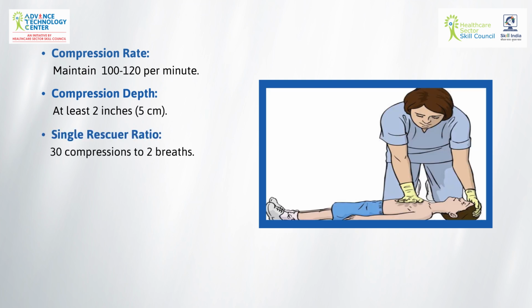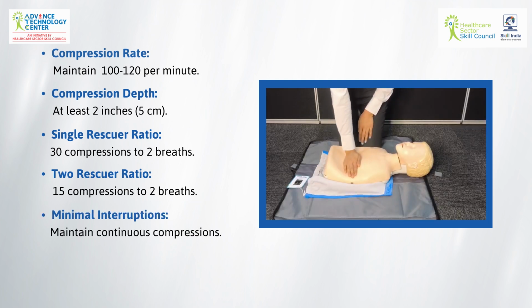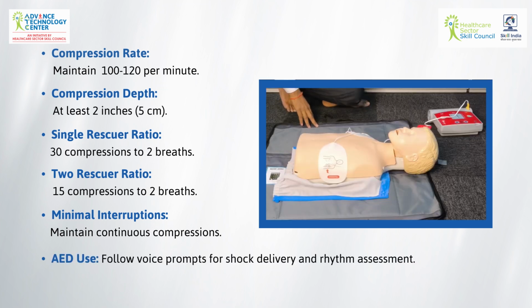Single rescuer ratio, 30 compressions to 2 breaths. 2 rescuer ratio, 15 compressions to 2 breaths. Minimal interruptions, maintain continuous compressions. AED use, follow voice prompts for shock delivery and rhythm assessment.